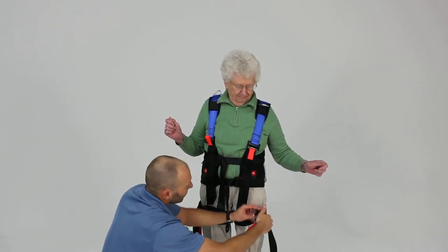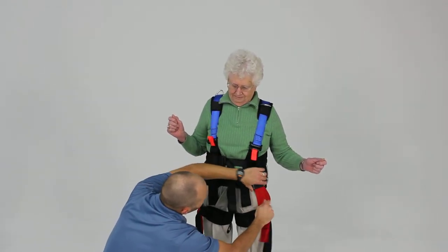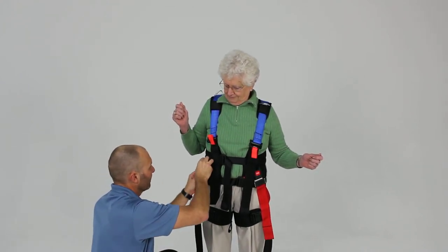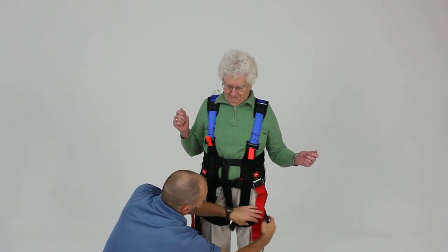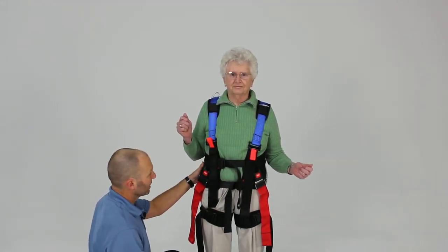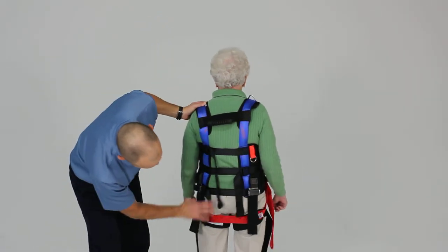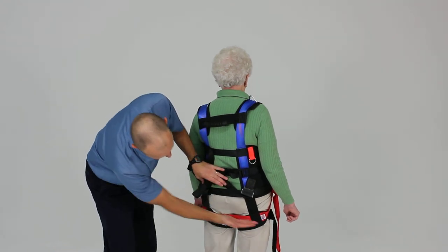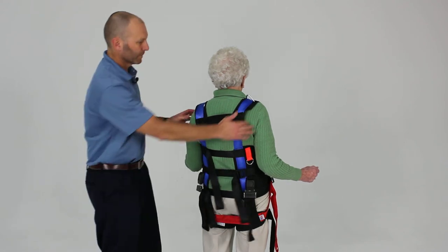Now we'll take our red buckles, which are going to come up to the seatbelt buckles with the red press button, and snug those down firmly. Then re-snug any other belts that may have changed position or loosened up during that process. Let's show you the back — how it looks once everything is in place — with this red strap catching underneath the gluteal fold and coming around to the front to provide good support to the pelvic region.